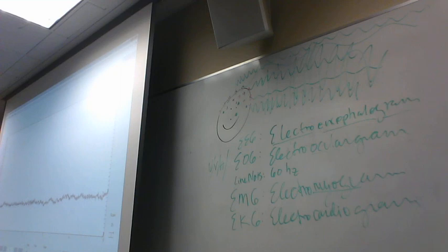Now we have an electrical potential that's related to a particular event. And this event, let's call remembered. All of these were trials in which the person successfully remembered information. Now what we can do is, let's use a different color, which is green, this red's kind of crappy.